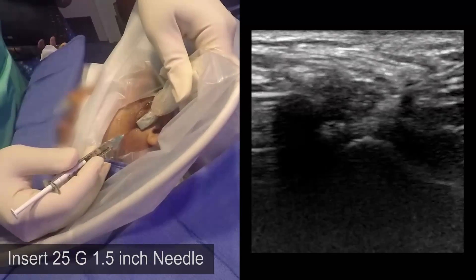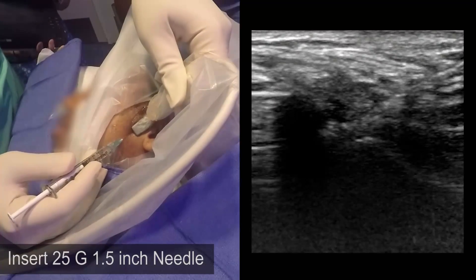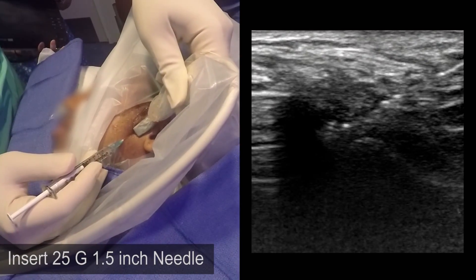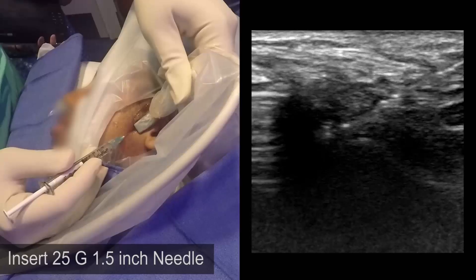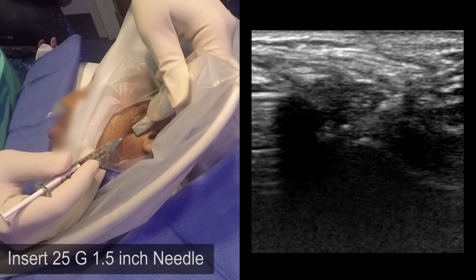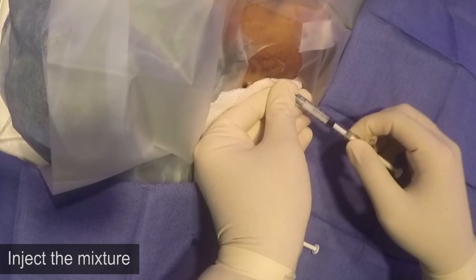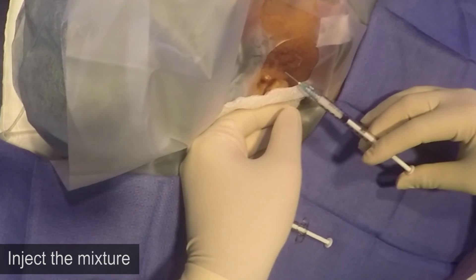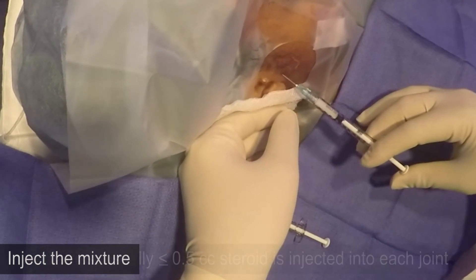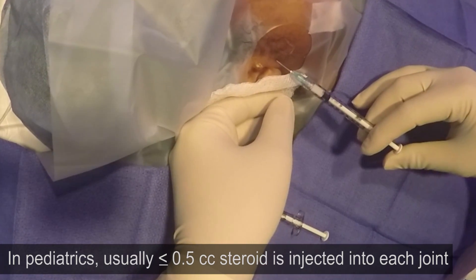Insert the needle, then inject the mixture. Thank you.